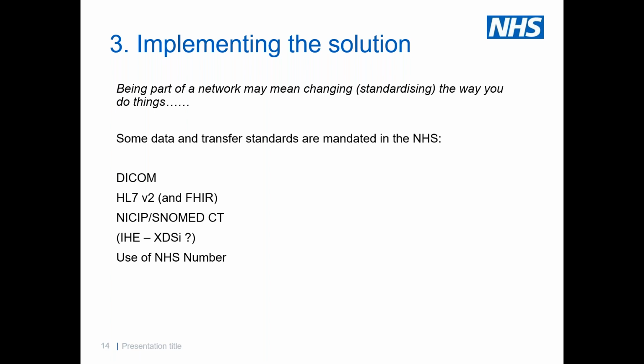Whether it's universally used and whether it's used consistently is a slightly different question. And I'm well aware that there are very particular challenges around the NHS number in relation to DICOM and how it handles particular identifier fields. So it's something to be thinking about, but it's definitely the direction of travel.